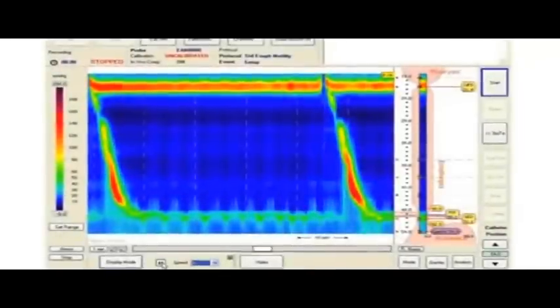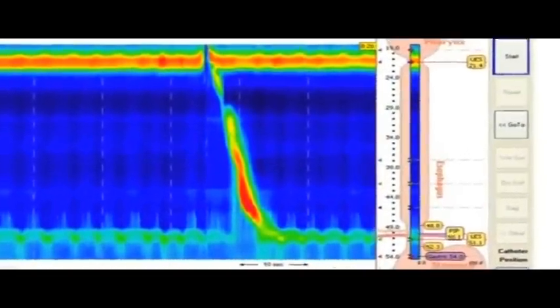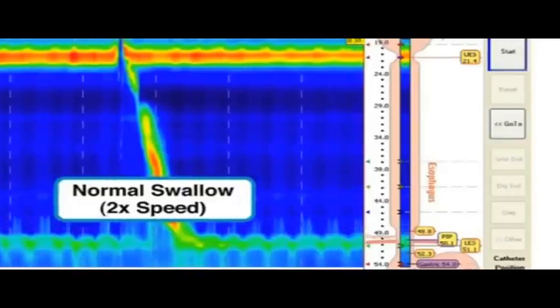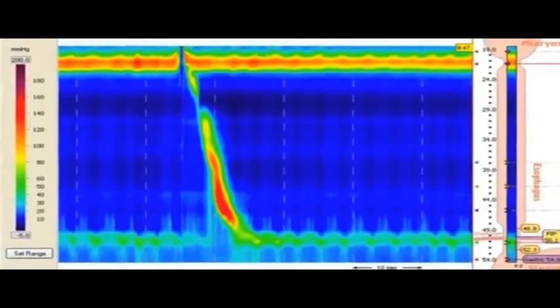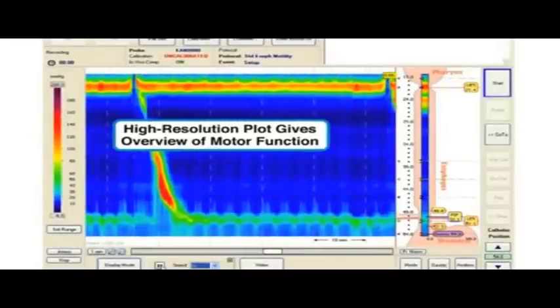For esophageal manometry, ManoScan provides full coverage from the pharynx to the stomach. The pressure profile on the right shows the real-time distribution of pressure in the organ, while the main display on the left gives the history of the study. This high-resolution format gives a clear overview of motor function.